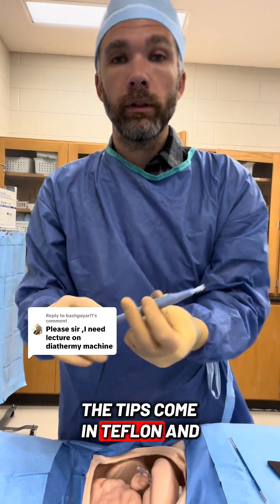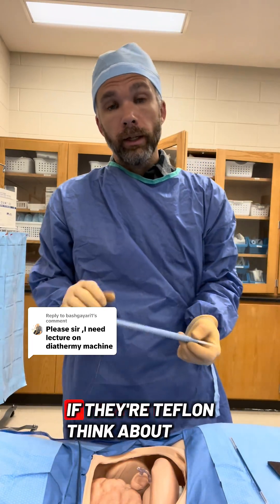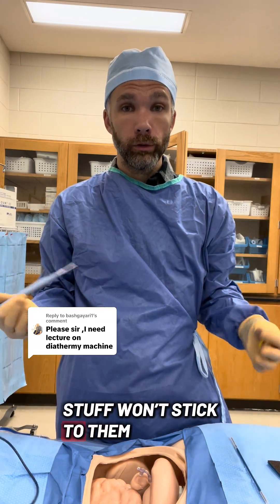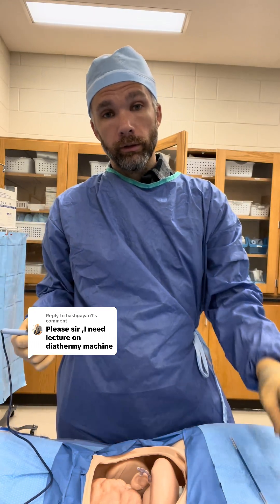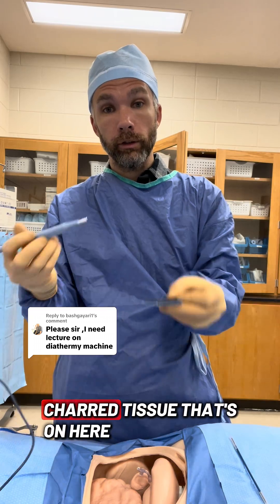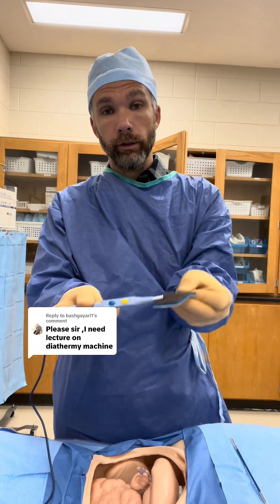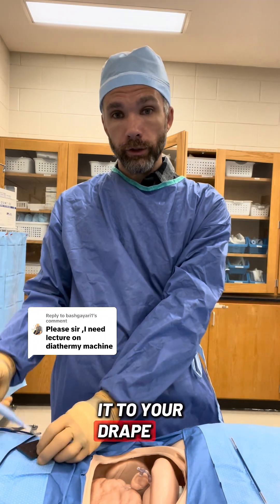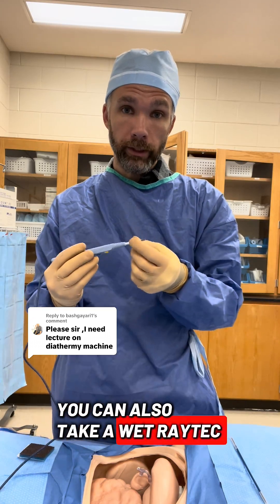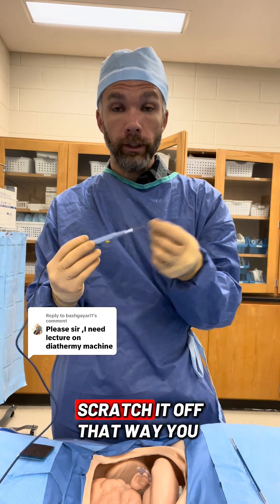The tips come in Teflon and non-Teflon. If they're Teflon — think about your cooking pans — stuff won't stick to them. If it's non-Teflon, you're going to need a Bovie scratch pad that will take the charred tissue on here and scratch it off. You're going to stick it to your drape to help scratch it off. You can also take a wet raytec and scratch it off that way.